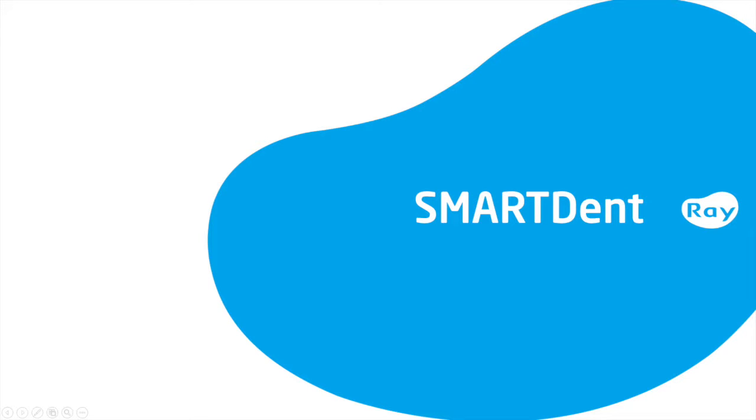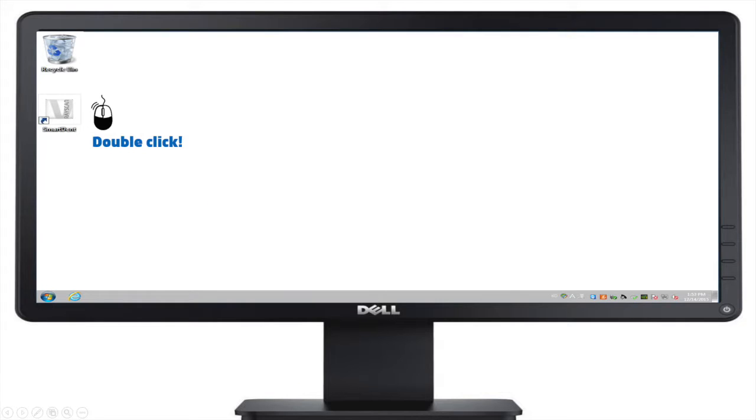Welcome to the SmartDent training video. We recommend you complete this training video before using your device. Let's dive right into the SmartDent software.